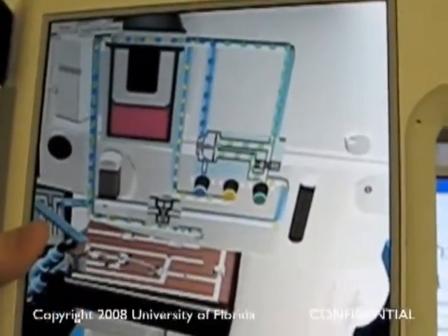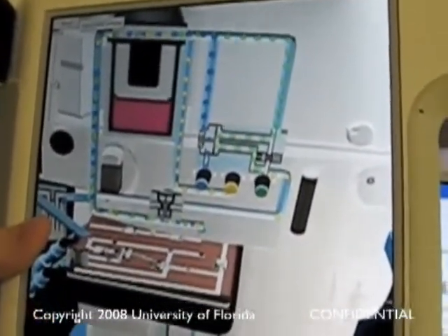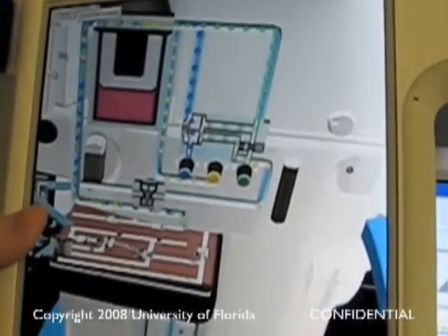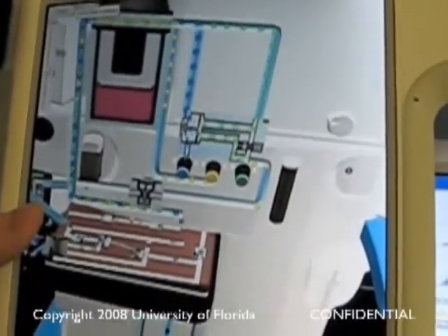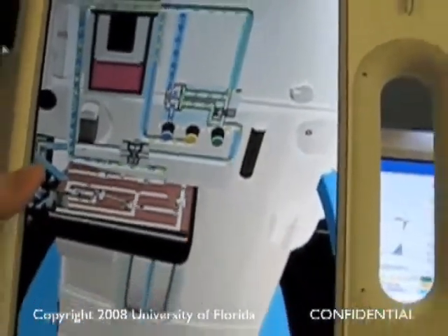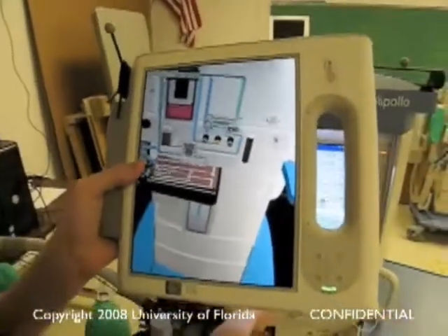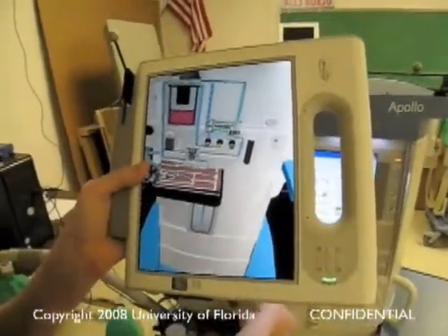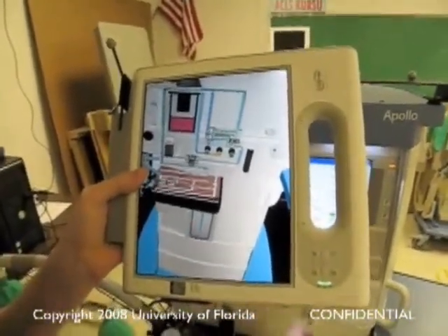If I go ahead and turn the oxygen back on, you can see everything start to flow again. The air starts flowing again as well.